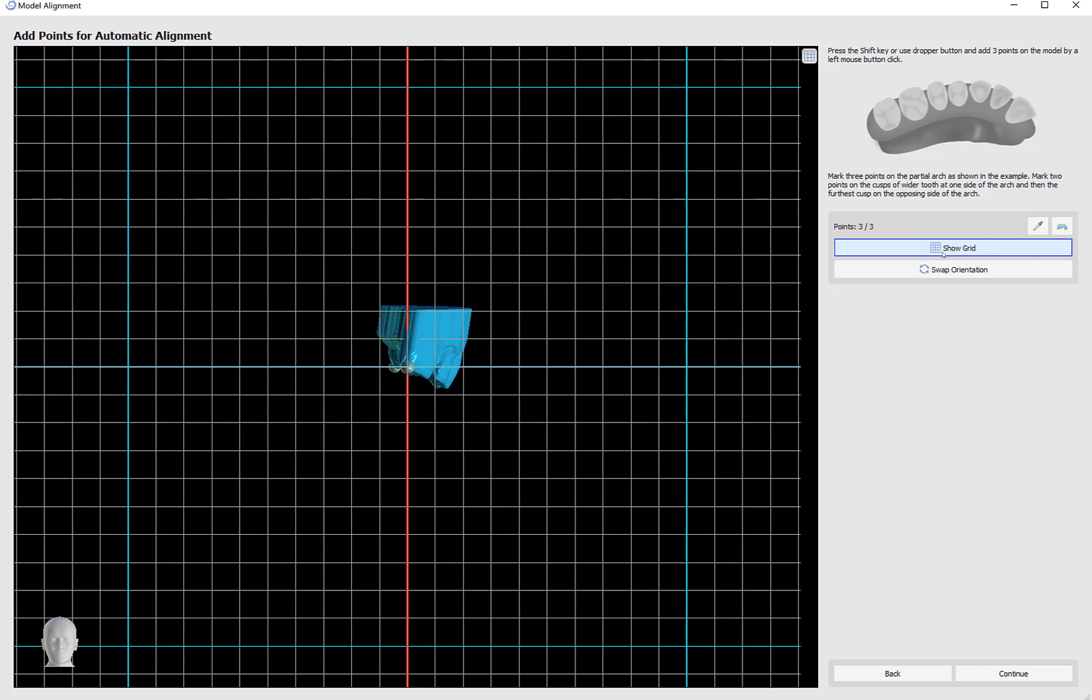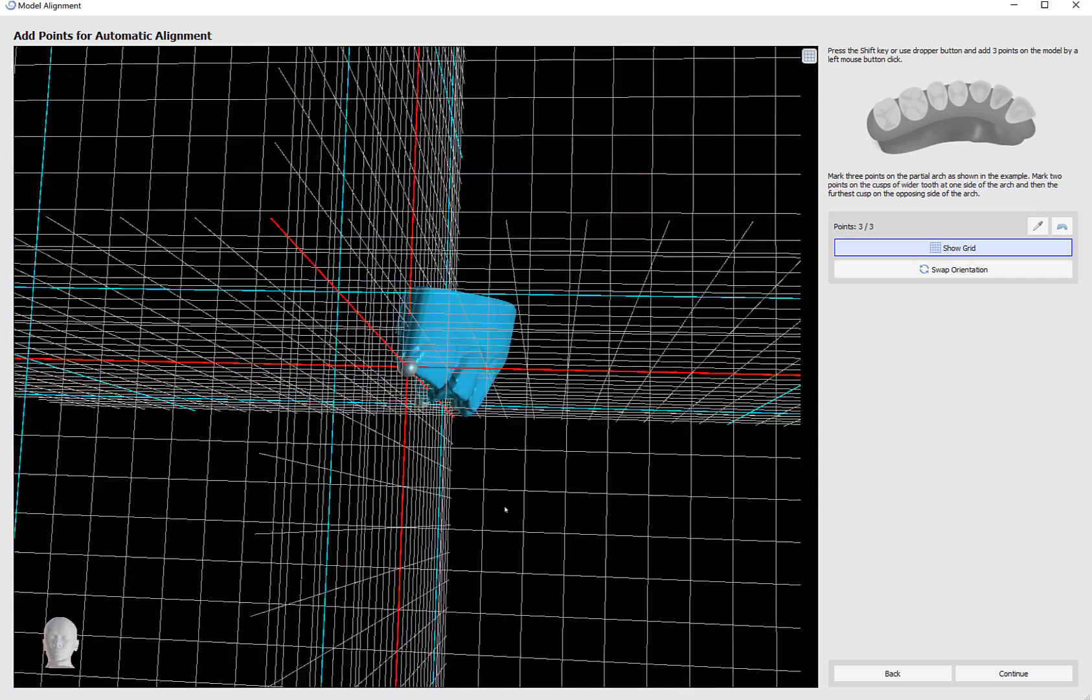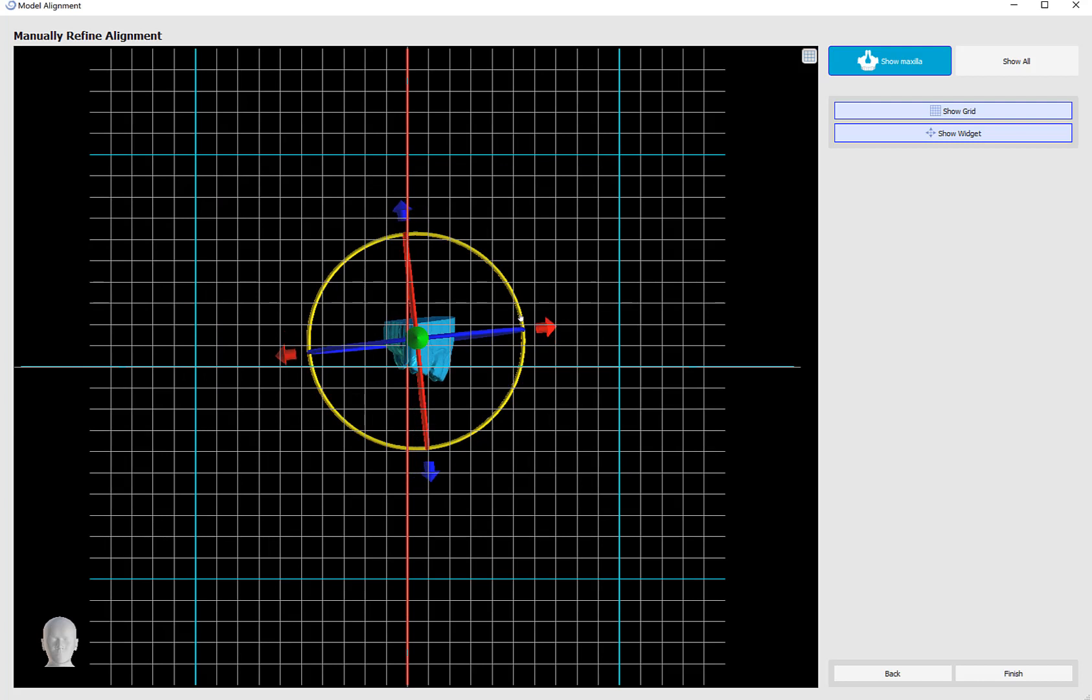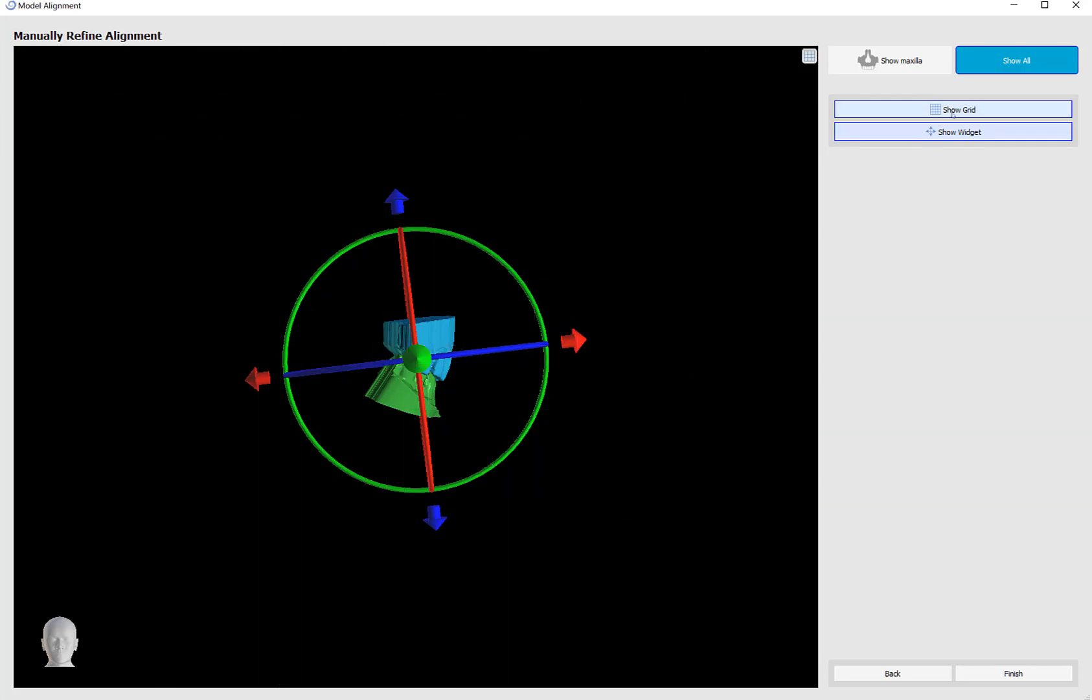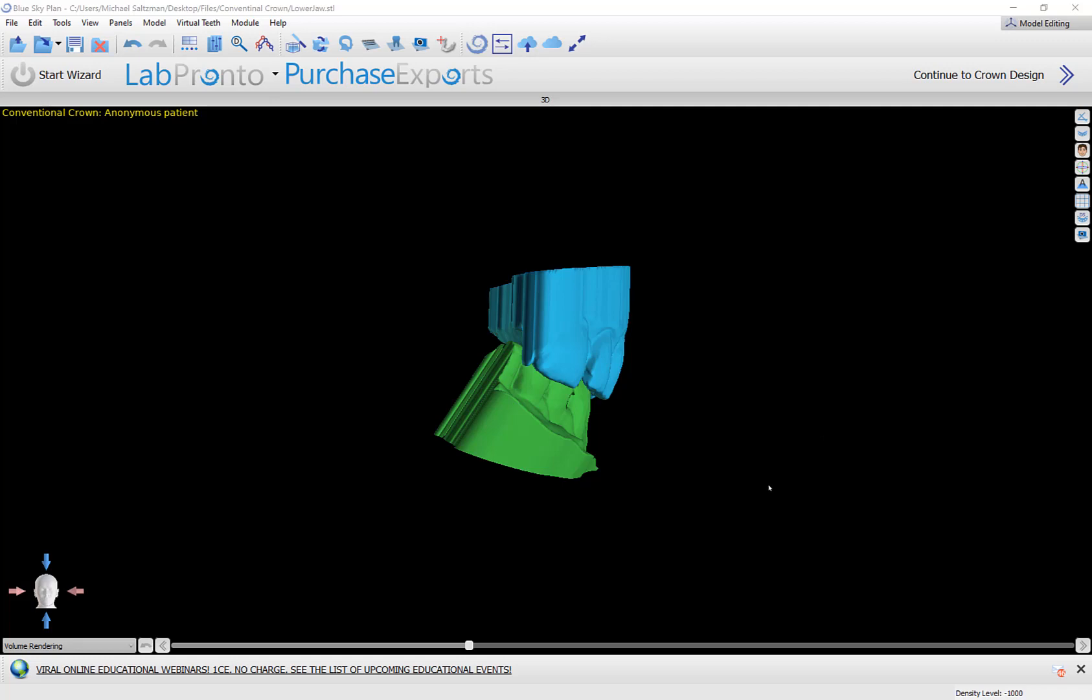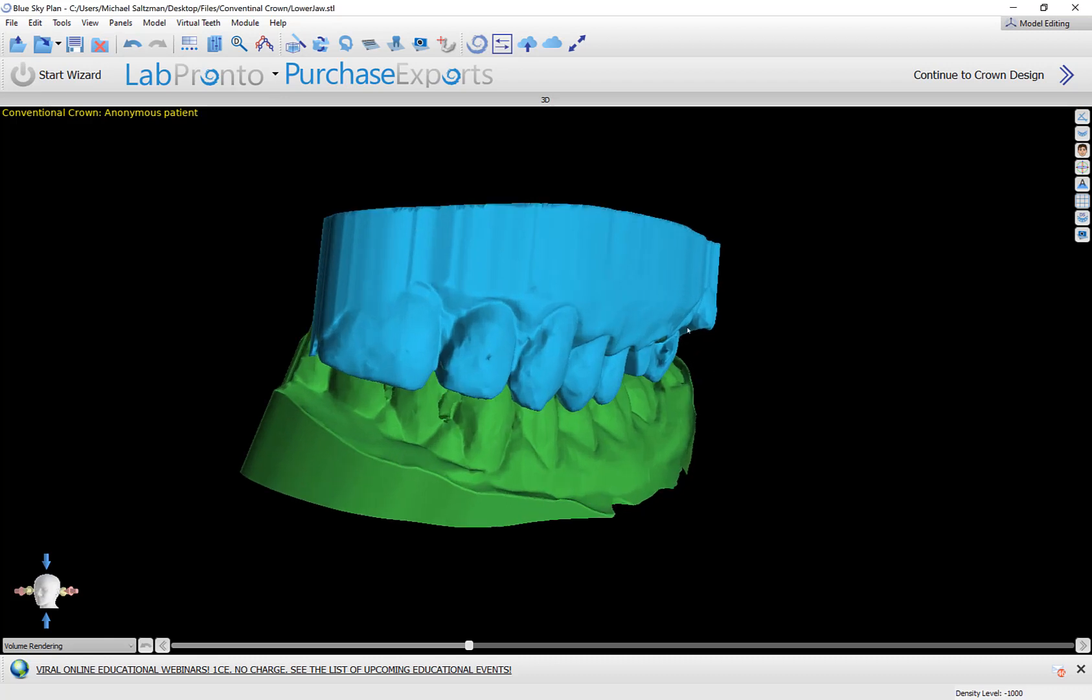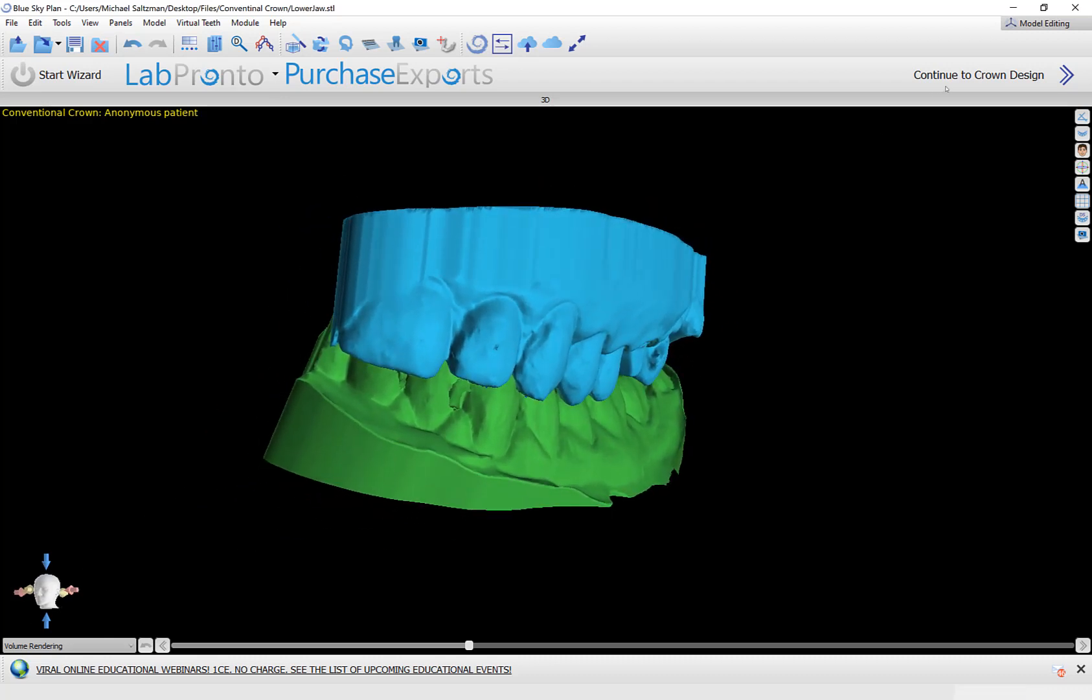We can toggle the grid on and off and rotate to see the alignment. The next step allows us to fine-tune the model alignment as needed. We can go ahead and grab and drag the widget if we would like to rotate that. We also have the option of clicking show all to see all of the models, and we can rotate and move them together if we like, and toggle on and off the grid and the widget. Pressing finish will load the models into the case. We now have the models imported, aligned, and positioned in the BlueSkyPlan software. We can see how the models are oriented the same way as the head in the bottom left. And now I'm going to click continue to crown design.